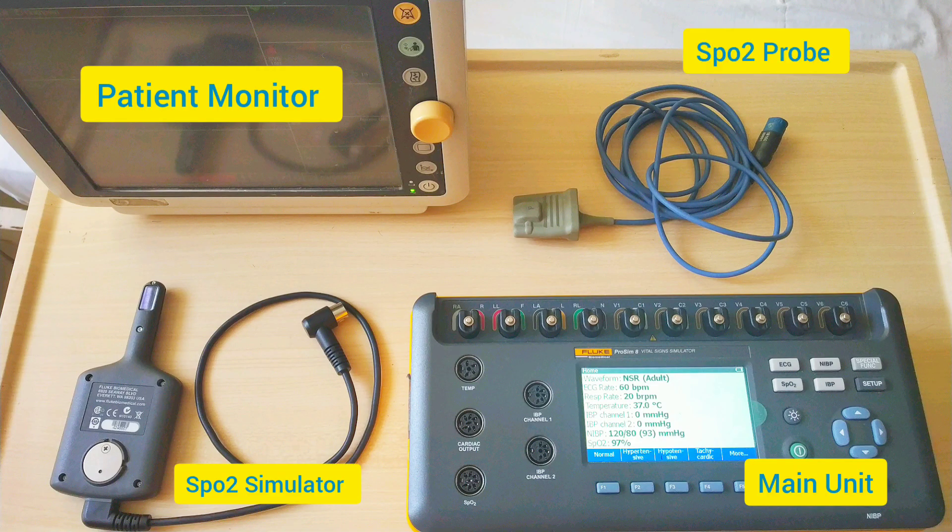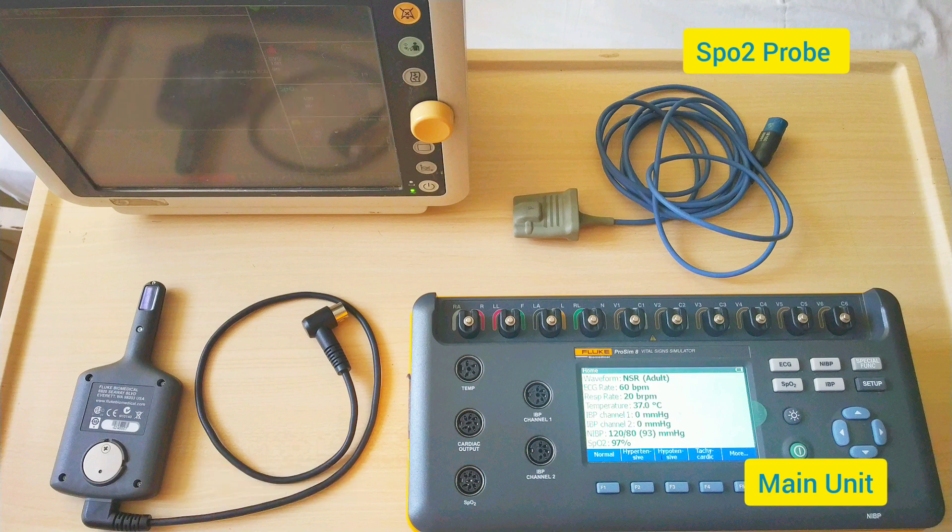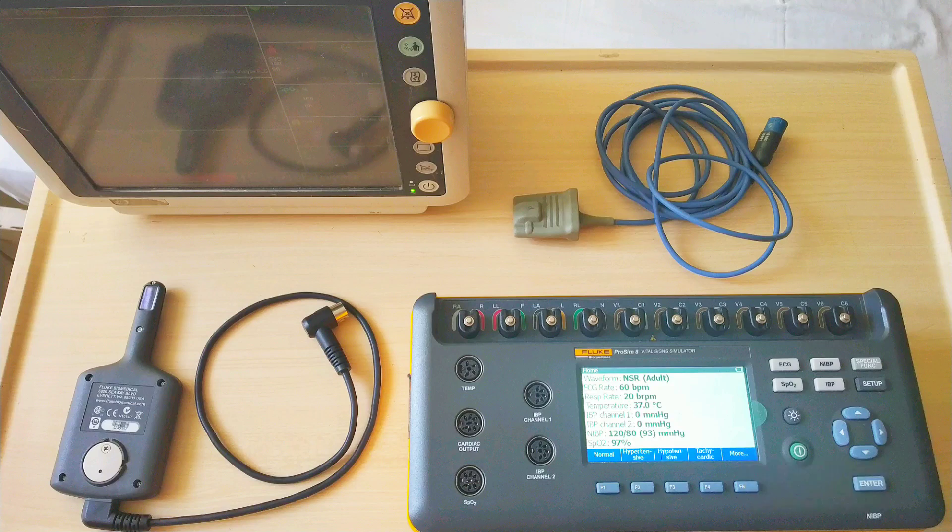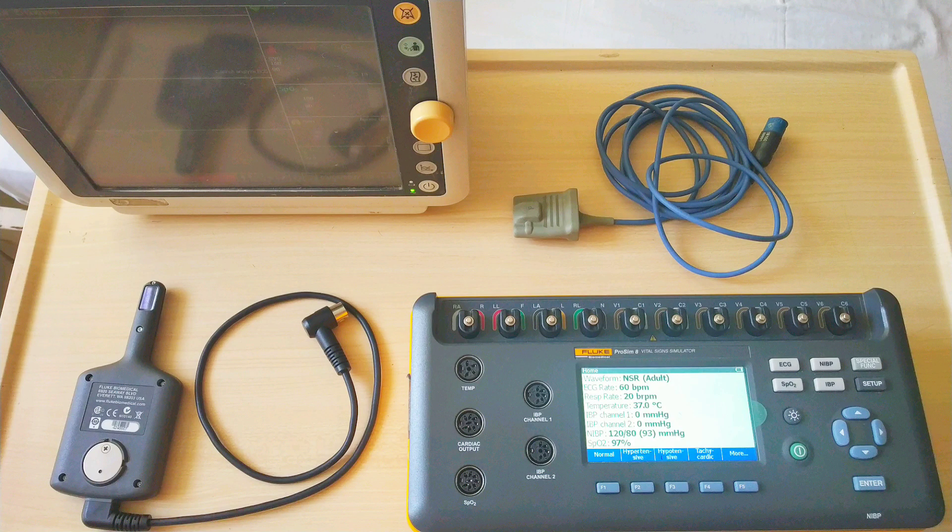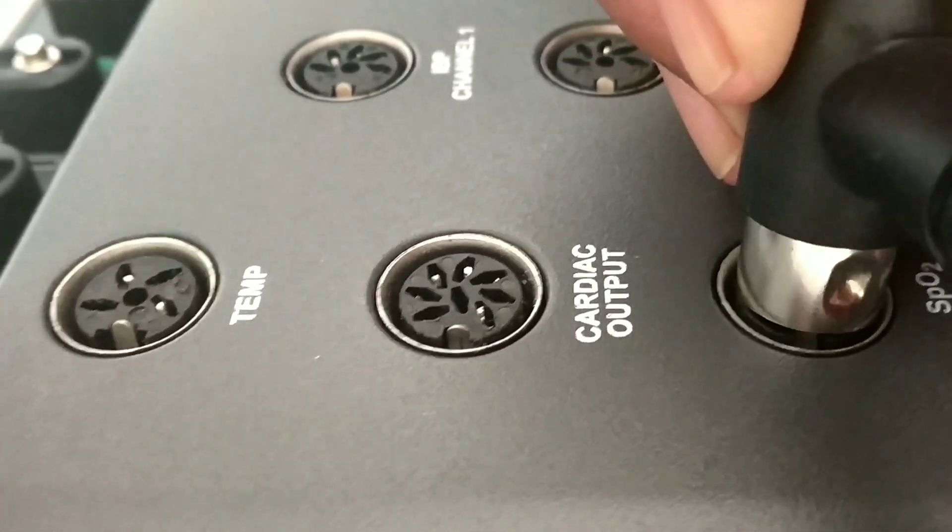We will be calibrating the patient monitor. Basically it will be a calibration test to check whether the patient monitor is giving the right reading with respect to the values that we have set on the simulator.